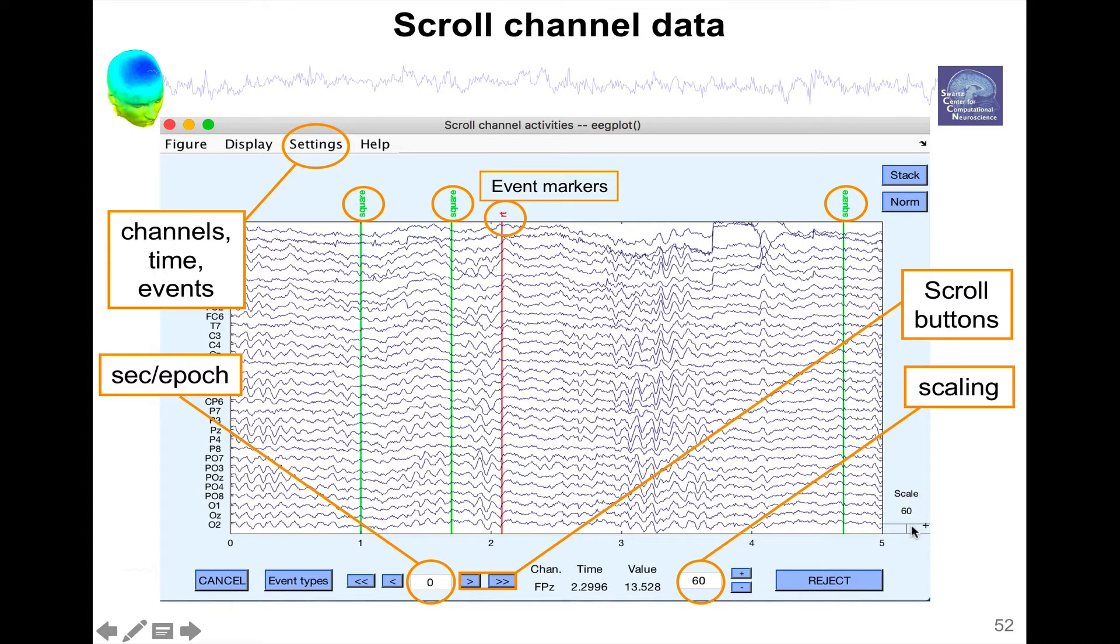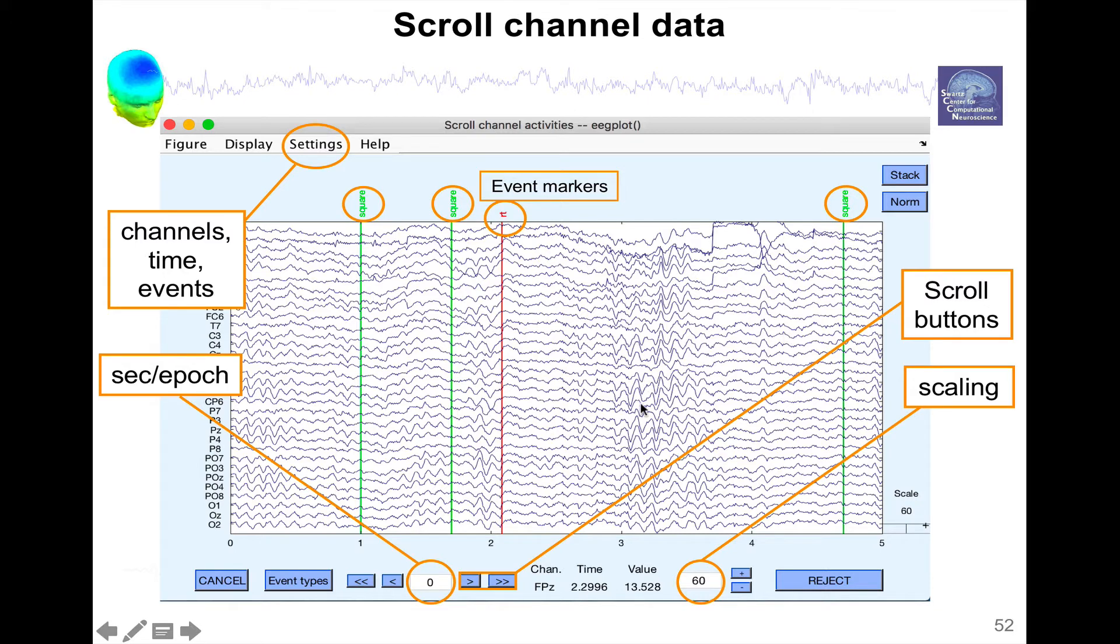And then you have event markers, so in this case I have two types of events, I have square and RT which means reaction time. Square is the stimulus and RT is the reaction time. And then you can see here, for instance, we can see some alpha waves very clearly in this subject.